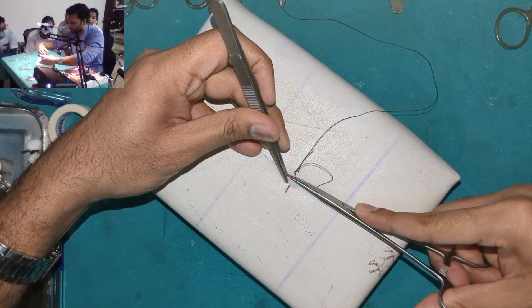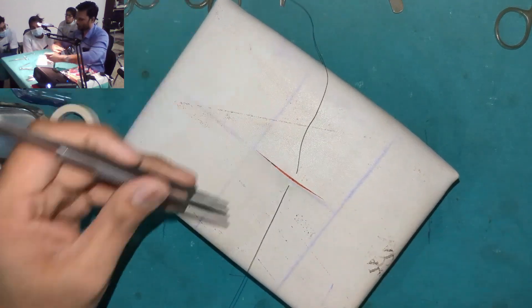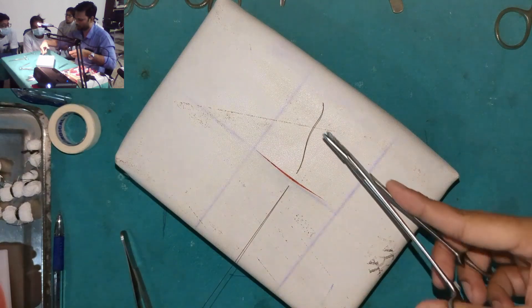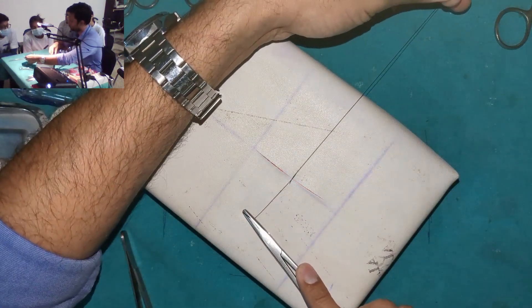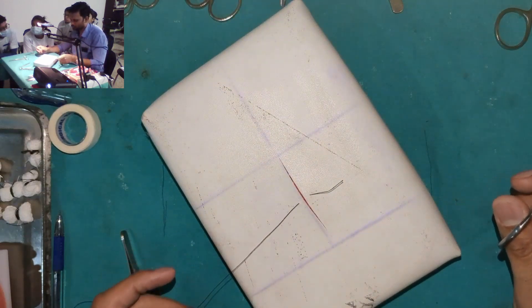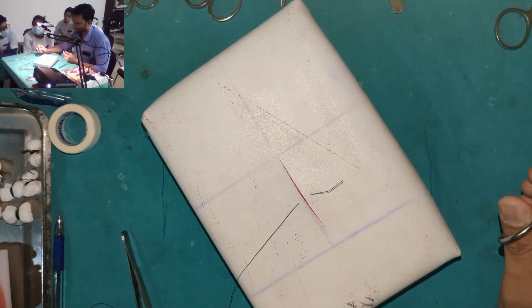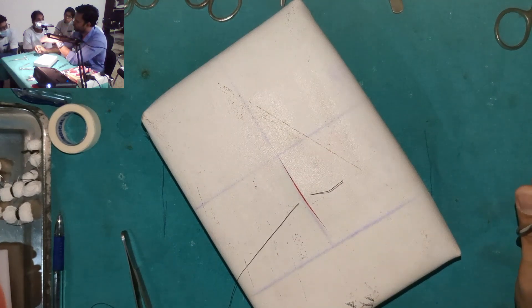Now again, I am going to take a bite perpendicular to the tissue and the suture is now perpendicular to the incision line. Can you see? Now, I am going to show you a knot.